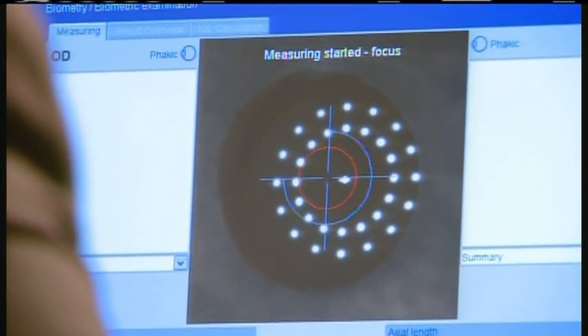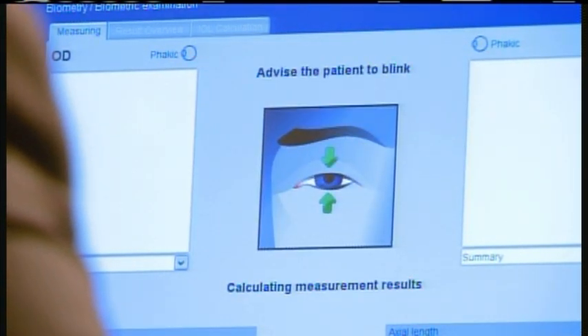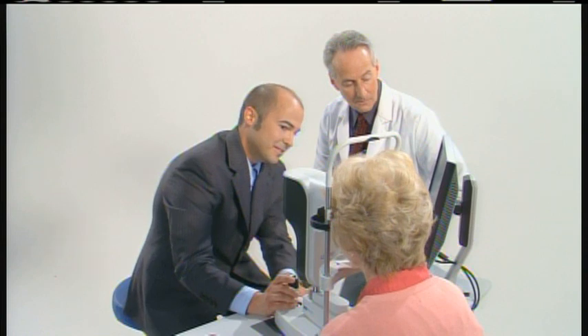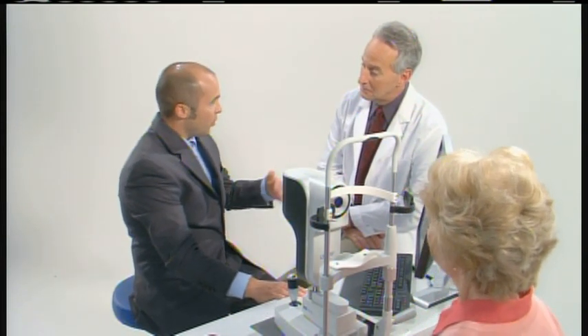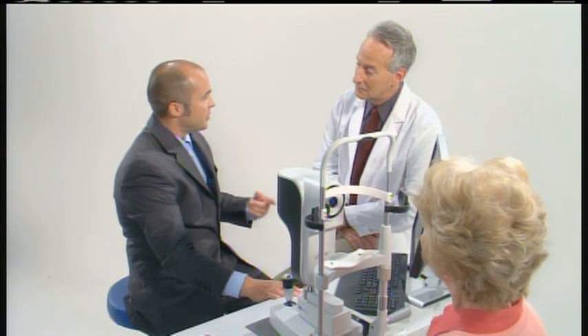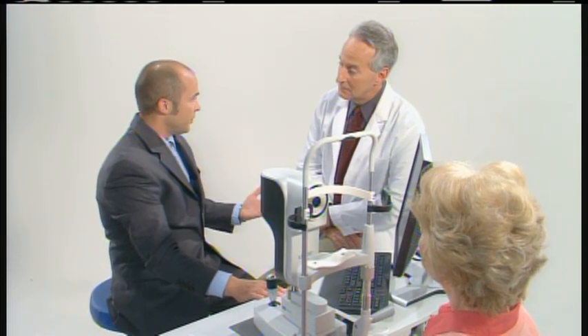You can see as she moves, the scan will pause and then come back to center as we lose fixation. So in one shot, we're able to capture all the measurements through the cornea, the anterior chamber, the lens thickness, through the vitreous, all the way to the retina, and even the retinal thickness.